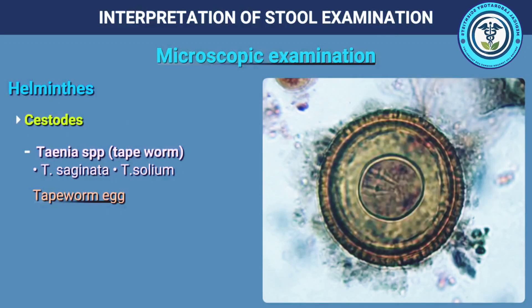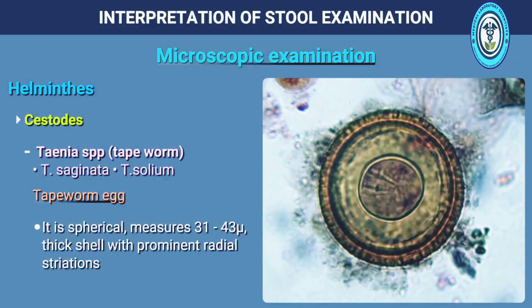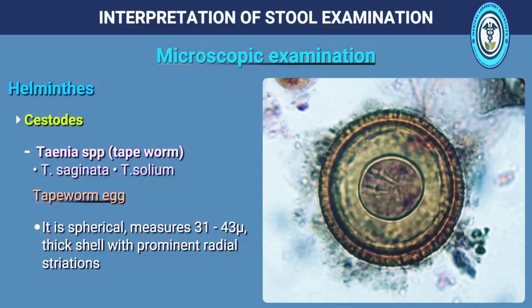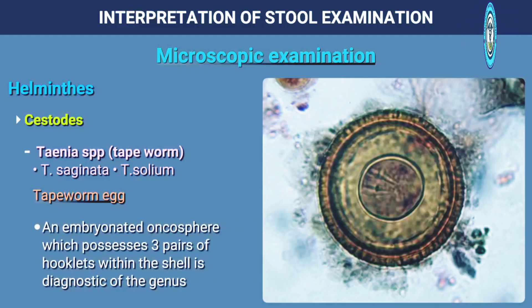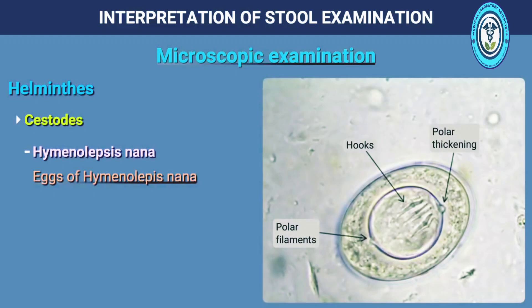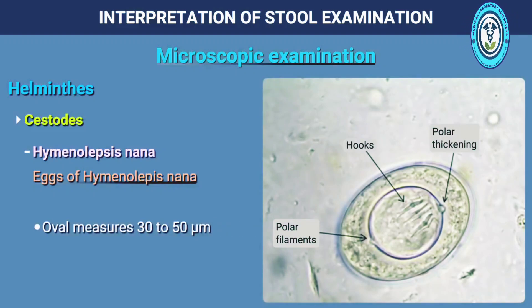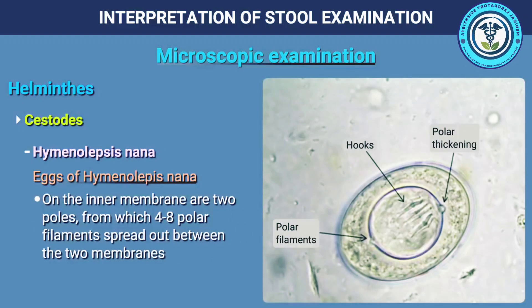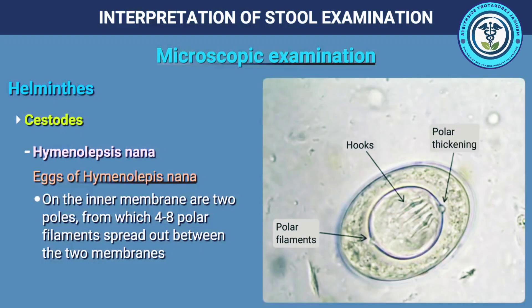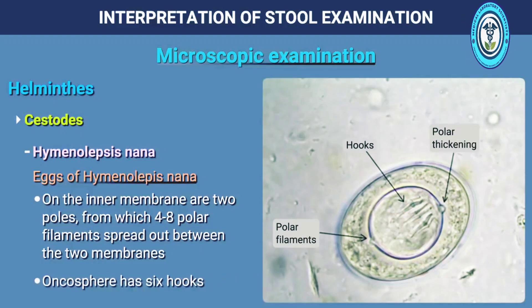Taenia species — Taenia saginata or Taenia solium: the tapeworm egg is spherical, measures 31 to 43 microns, with a thick shell with prominent radial striations. An embryonated oncosphere which possesses 3 pairs of hooklets within the shell is diagnostic of the genus. H. nana eggs are oval, measure 30 to 50 microns; on the inner membrane are 2 poles from which 4 to 8 polar filaments spread out between the 2 membranes, and the oncosphere has 6 hooks.